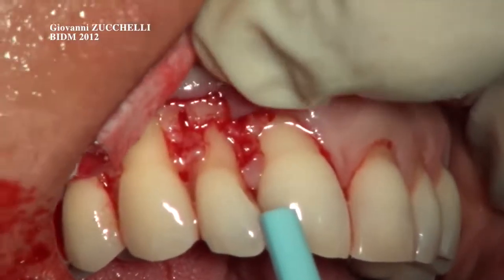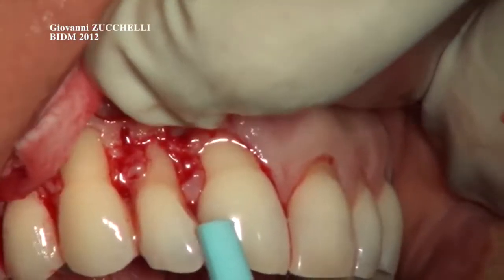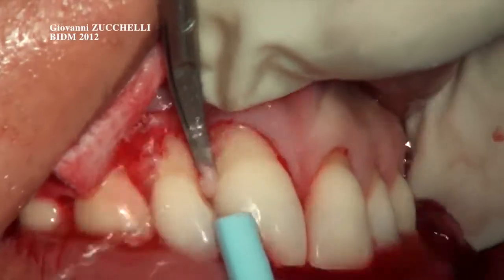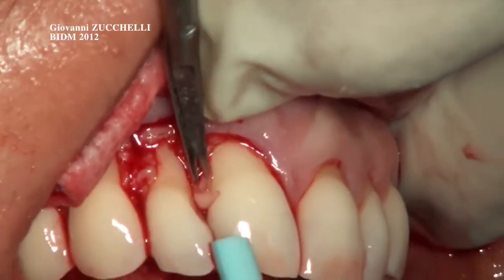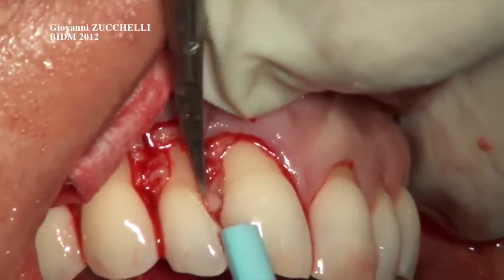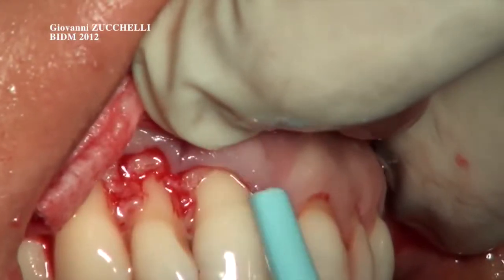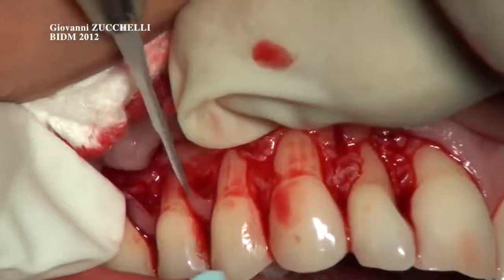When you have a very small papilla, you can do almost everything with your microsurgical blade, namely take the epithelium and only the epithelium will be removed after the tip. You don't have to lose papilla, but just desepithelialize the tip of it.